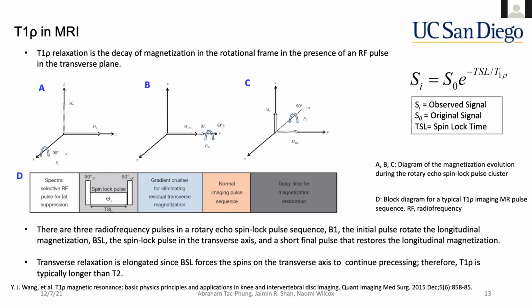Okay, yeah, because I think the advantage of the TSL is you can have those spins locked for quite a lot longer than the T2. So that is an interesting property of T1 rho. Yeah, if I read correctly, they were actually slightly longer than the T2s. Great. Okay, anything else? All right, thank you again, and we'll move on to the next talk.